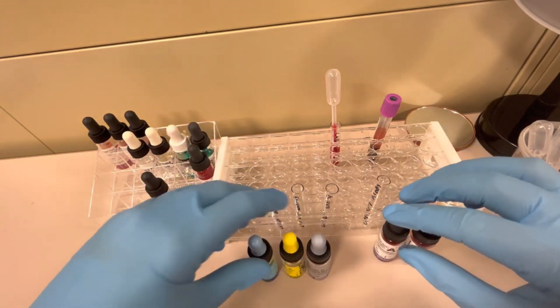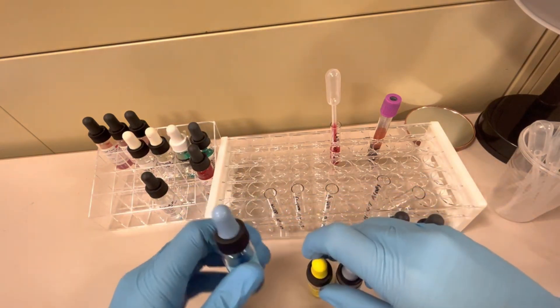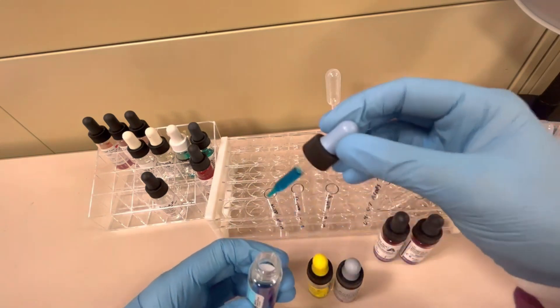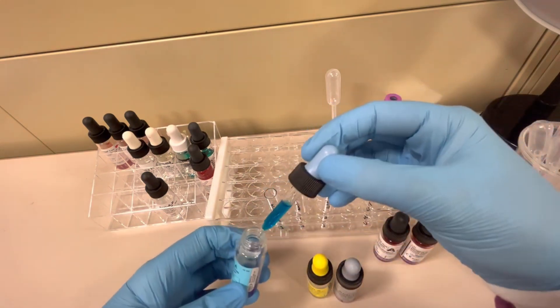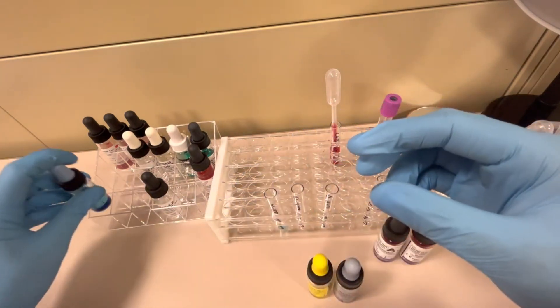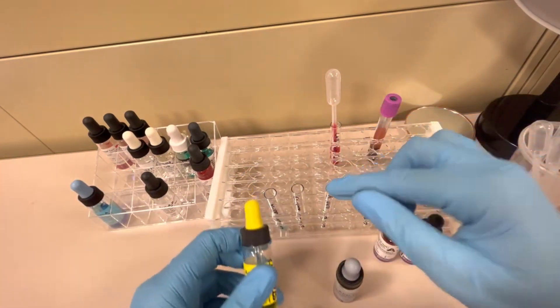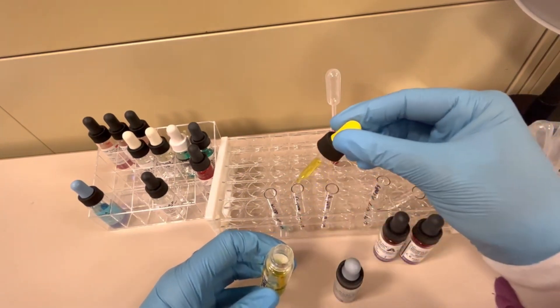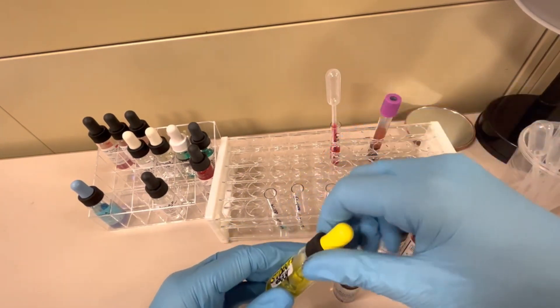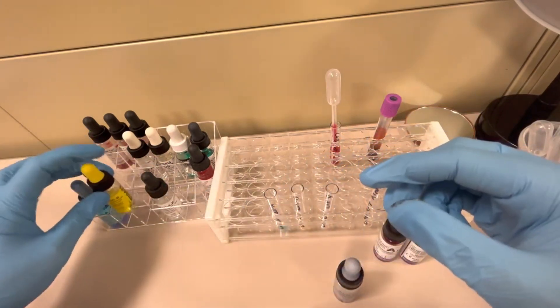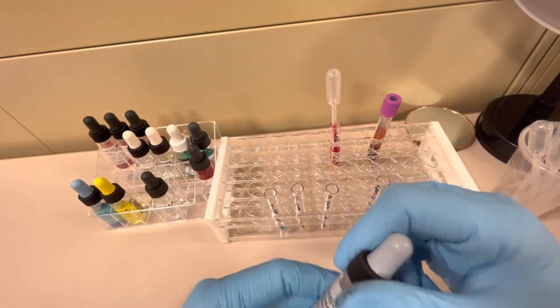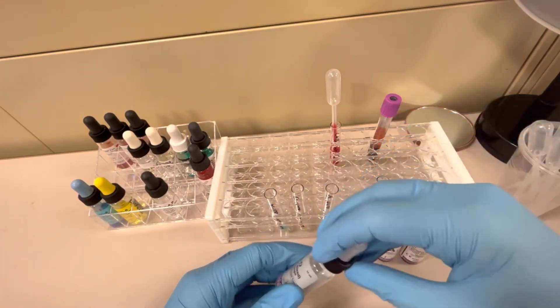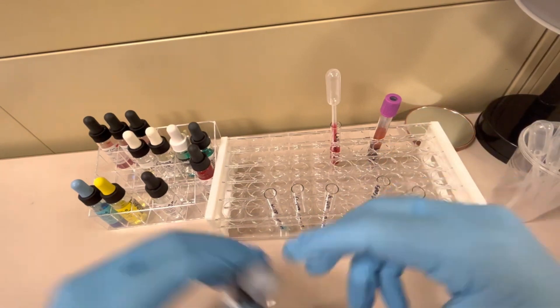The first thing that you're going to do is in the first tube here, which is labeled Anti-A, you guessed it, we're going to put Anti-A in there. We're going to put one drop of Anti-A. I'm going to close the vial and put it back in our blood bank rack. In the Anti-B tube, we're going to put one drop of the Anti-B reagent into that Anti-B tube. And then I'm going to take my Anti-D reagent and put one drop in the Anti-D test tube.